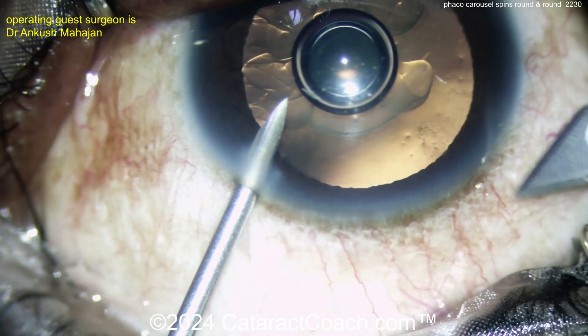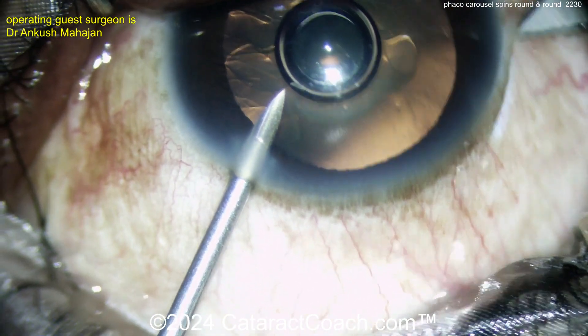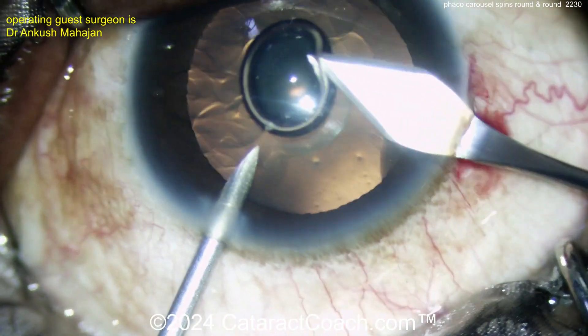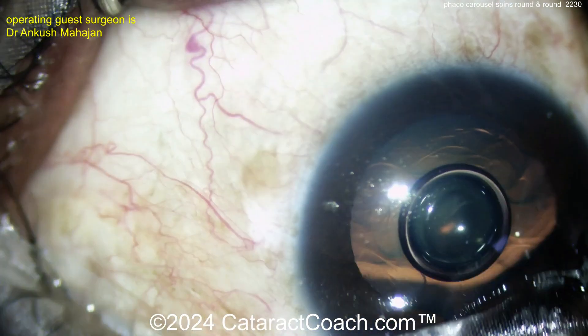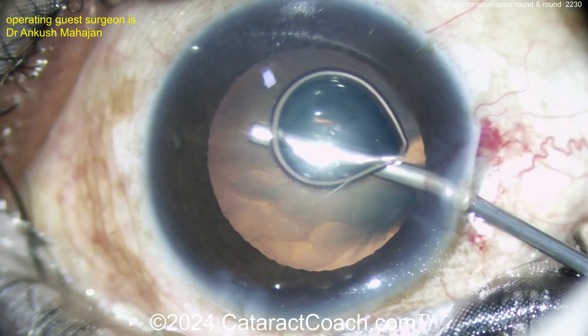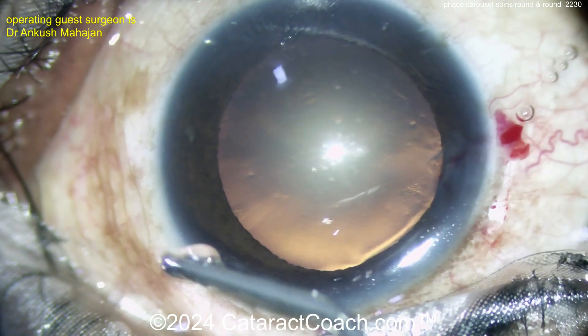There's an insertion and making of a paracentesis and injecting a little viscoelastic. Here comes the other hand with the keratome, making an incision there and entering the anterior chamber. Now this is not a very dense nucleus, so not a lot of nuclear density here, and that's going to make this carousel technique even easier. Putting some more viscoelastic in.